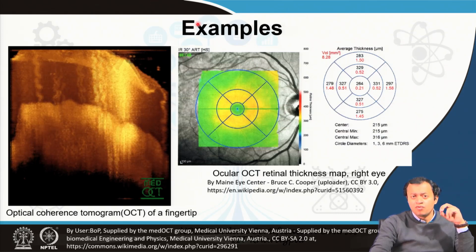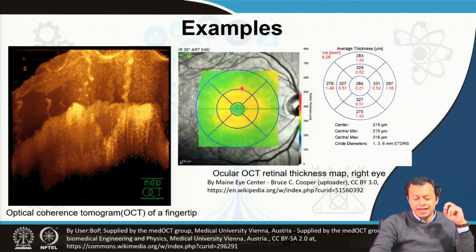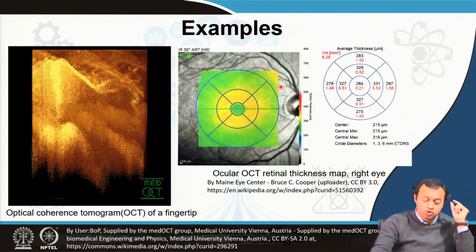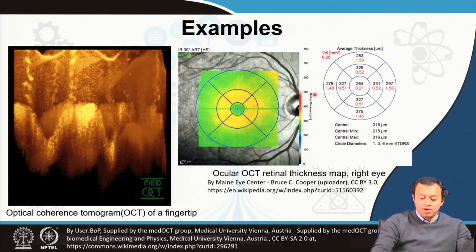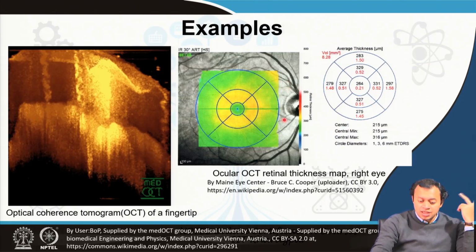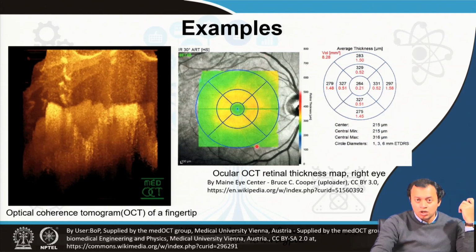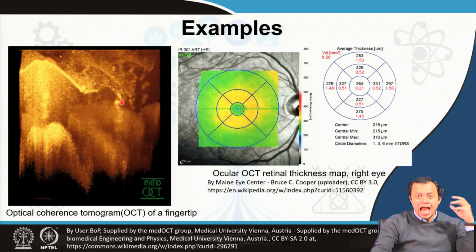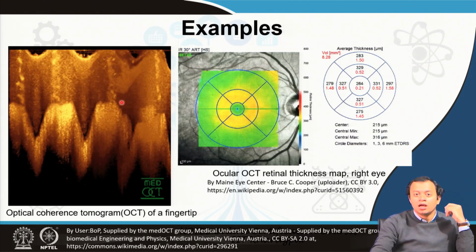You ask them to go for OCT of the eye, where the entire depth profile of the retinal tissue is measured to see if there is some kind of damage, if some blood vessel has burst, or something else has come up, and whether it is okay or not. This is simply OCT, as intelligent as it is simple.